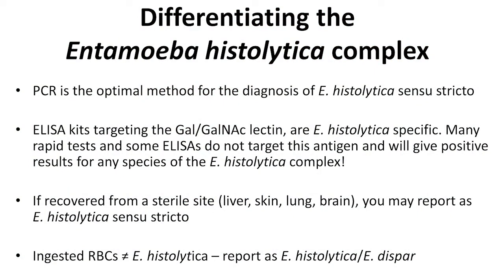If you have not performed a test such as a PCR or an ELISA to specifically identify Entamoeba histolytica in your sample as being true Entamoeba histolytica sensu stricto, do not report it as Entamoeba histolytica. Report it as Entamoeba histolytica / Entamoeba dispar.